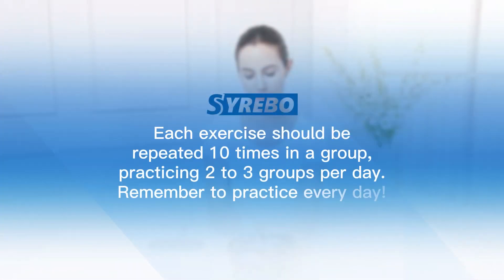Each exercise should be repeated 10 times in a group, practicing 2 to 3 groups per day. Remember to practice every day.